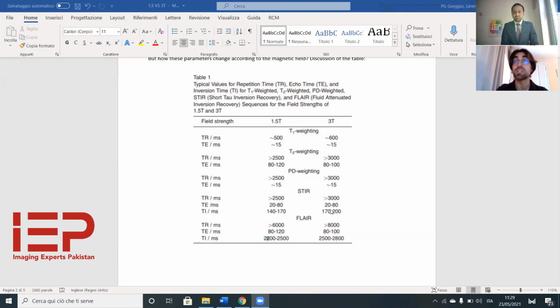And there was a visible deficit of saturation of the fat, which was not suppressed because the frequency was completely different, set at 150. As we can see, 150 worked only for the 1.5.